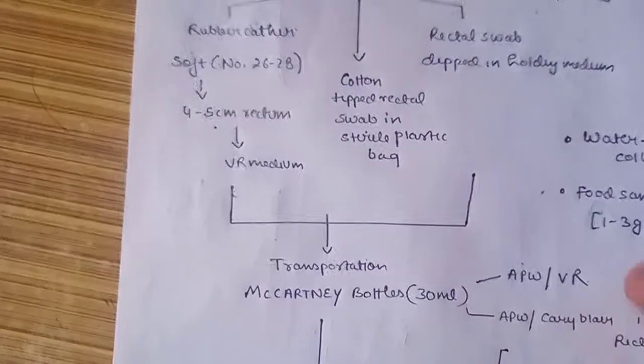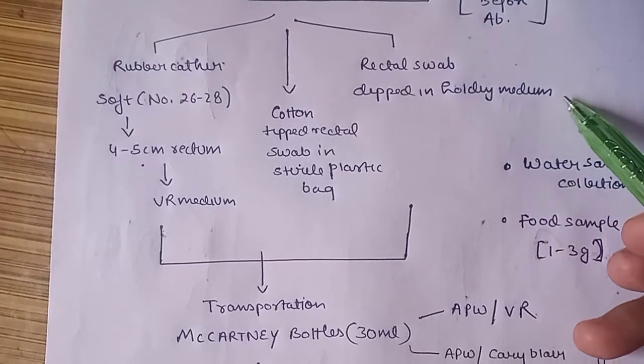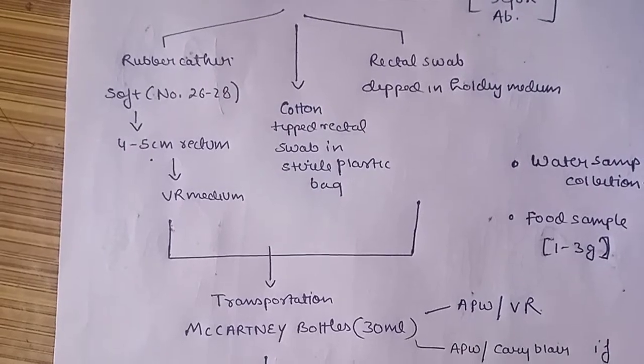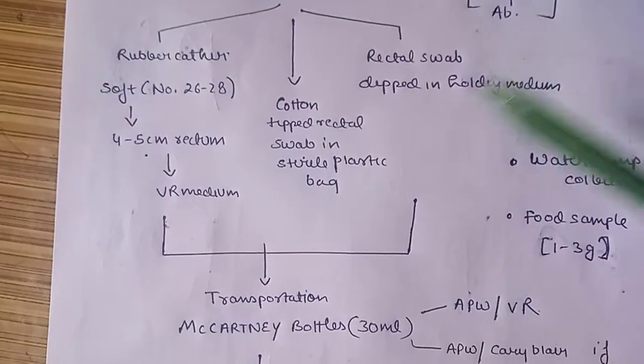and the sample is stored in VR medium. Another way is through the rectal swab, which is already pre-dipped in the holding medium, that is Venkatraman medium or the alkaline peptone water medium. Okay, so these are the two important methods, the rubber catheter or the rectal swab.